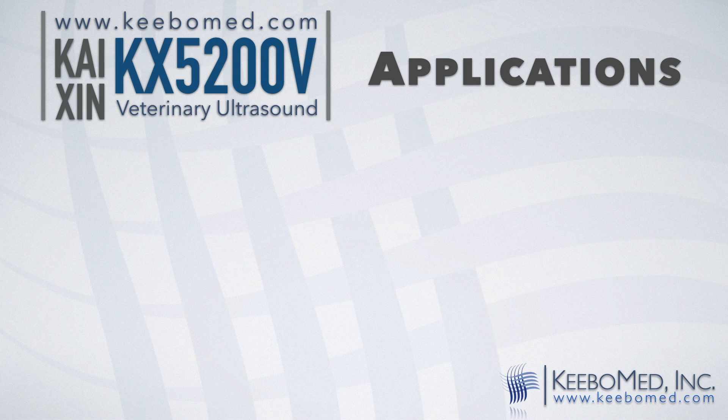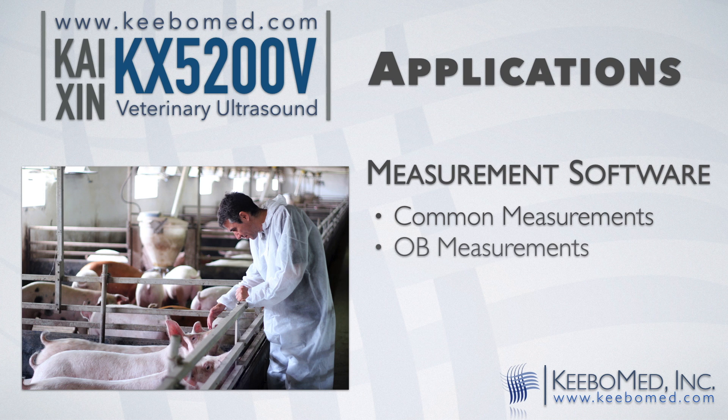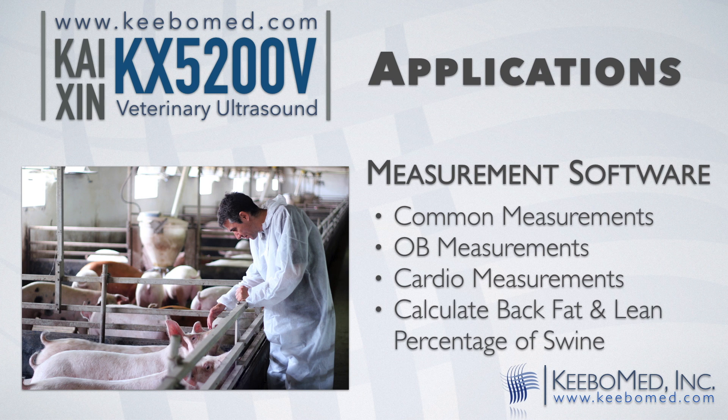The KX5200V also includes professional veterinary measurement software for performing common measurements of distance, circumference, area, and volume. OB measurements for gestational weeks and expected days. Cardio measurements of depth, slope, heart rate, and cycle. And it also automatically calculates the back fat and lean percentage of swine.